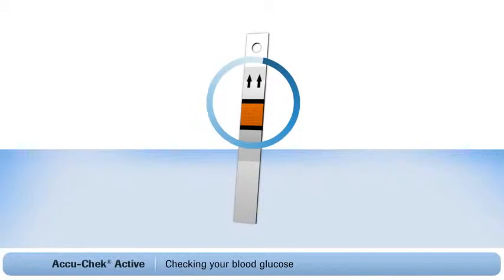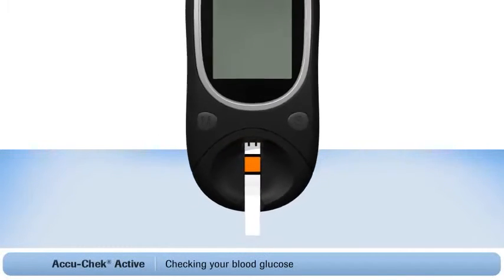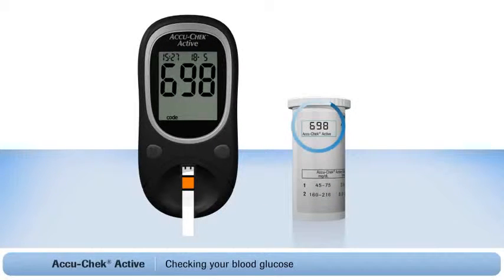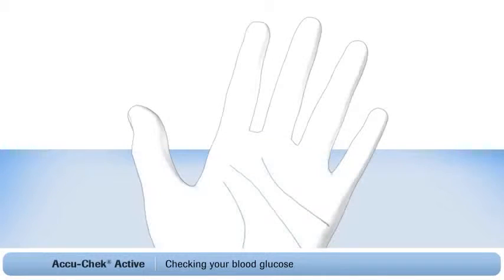The strip has an orange test area in the centre and 2 small arrows showing you which end to insert. Insert the test strip into the meter. The code number will appear briefly on the screen. Check that this number is the same as the code number on the strip's label. Then, a small flashing blood drop will appear on the screen to tell you that the meter is ready to test. When lancing your finger, always use the side of the finger rather than the tip, as it's more comfortable and less sensitive.